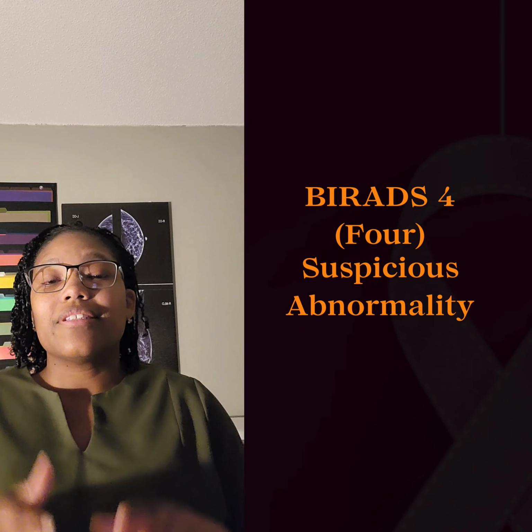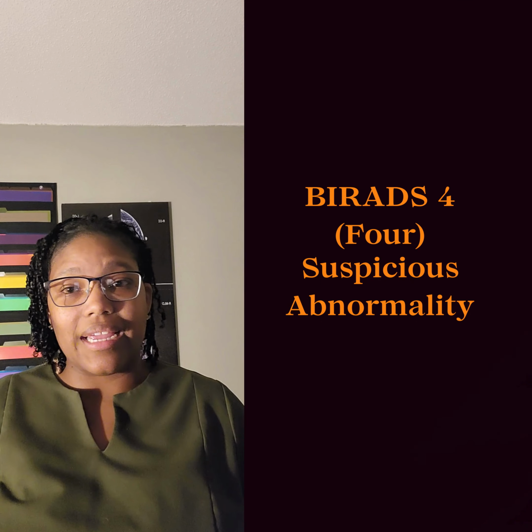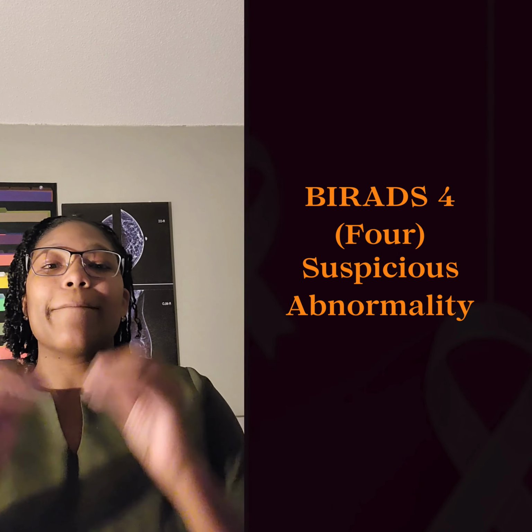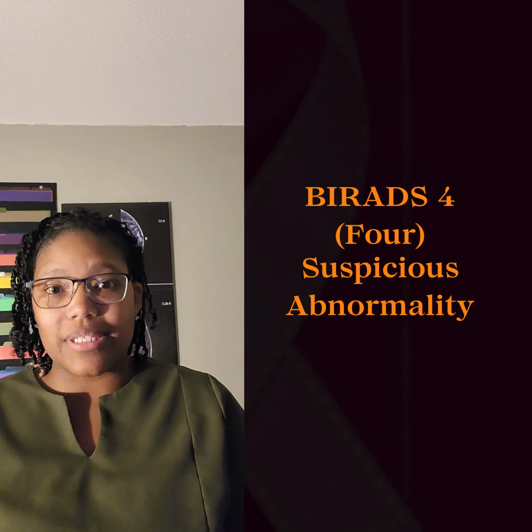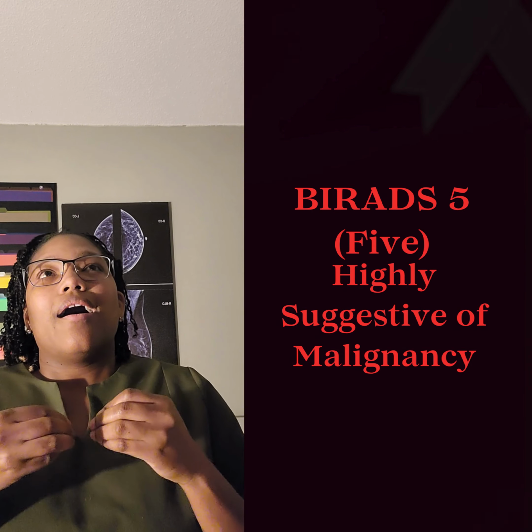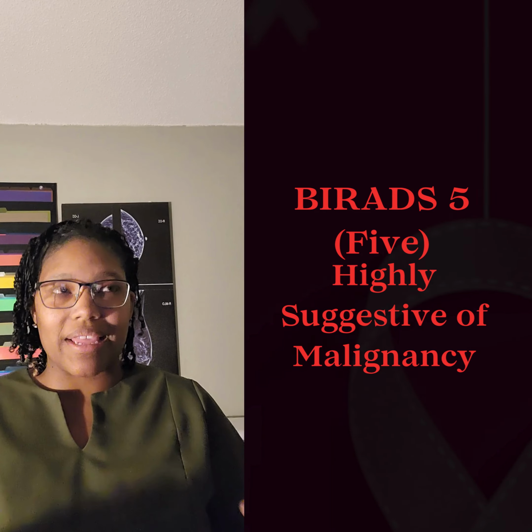That area of concern that was followed up from your screening, we need a biopsy to know for sure. So that is a BI-RADS 4 on our end, but we will tell you that you need a biopsy done.